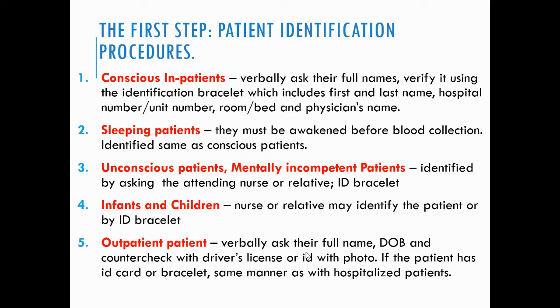Now, we have unconscious patients or mentally incompetent patients. So, we need to identify them by asking the nurse at the station or in their room, or any relative who is there. You really need to identify who the patient is.